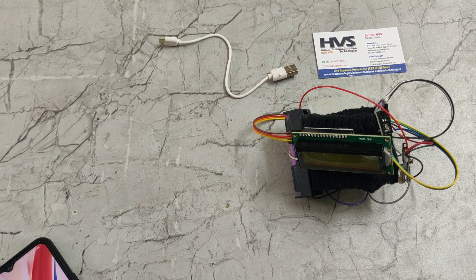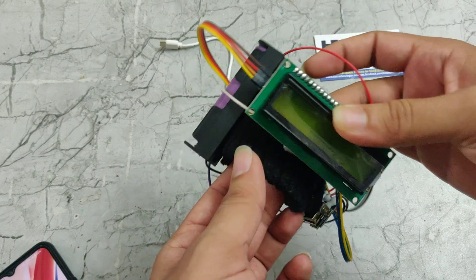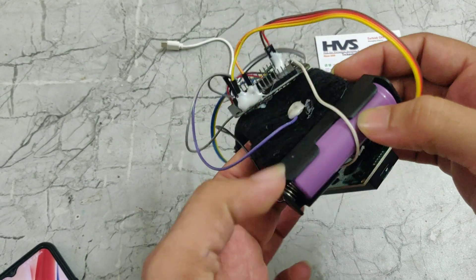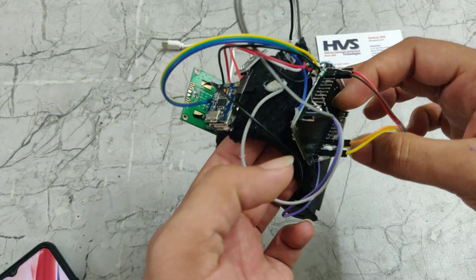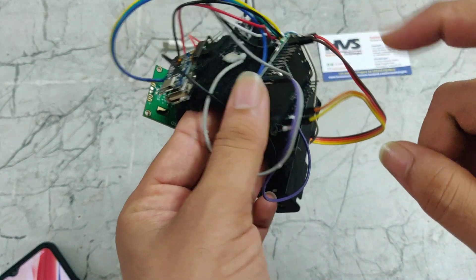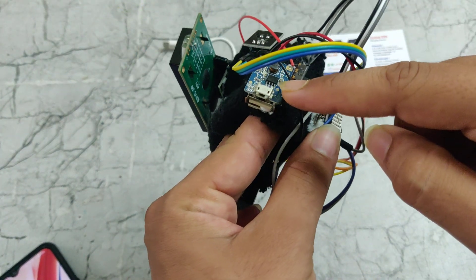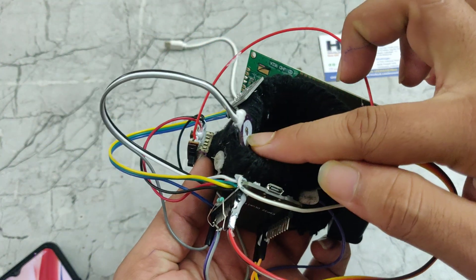Welcome to the demonstration of the stress monitoring system. In this part, we are using a 16x2 LCD display, a 3.7V battery, an ESP32 module, and a USB module to charge the battery. We also have a temperature sensor and a heartbeat sensor, and we need to give 5V power supply to this system.